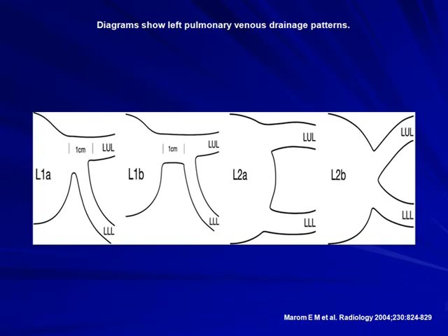As it turns out, left veins are not quite as complicated. You have left commons, which we see fairly frequently. You have some large areas that really don't even have what we would consider a carina between the veins. But most of them are pretty straightforward. You've got two discrete veins. You don't have much of a left common branch at all.